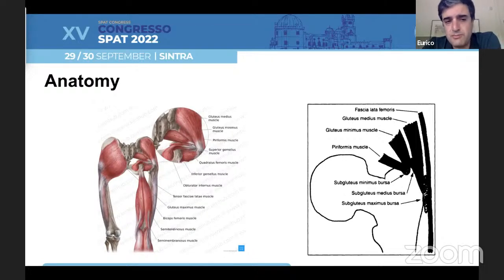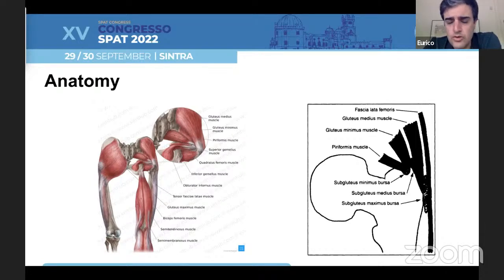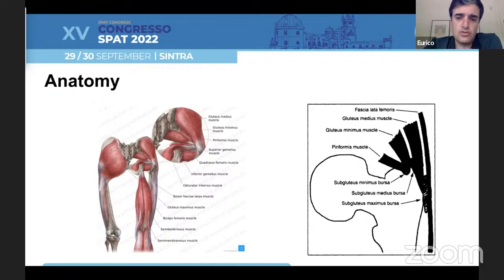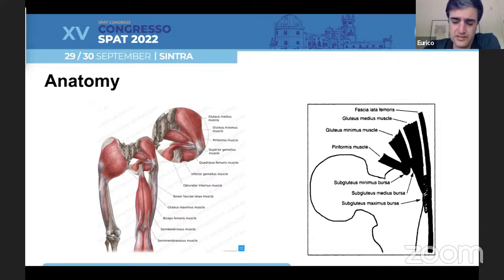We are talking about a space with major tendon insertions, especially from the gluteus muscles. Also, we have lots of bursa, and it is very related to the iliotibial band. We are working in this space just beneath the iliotibial band and above the greater trochanter.